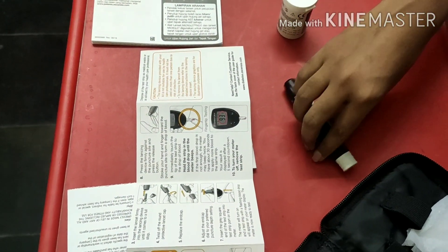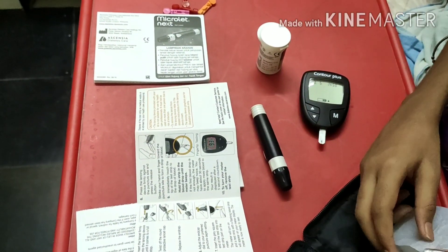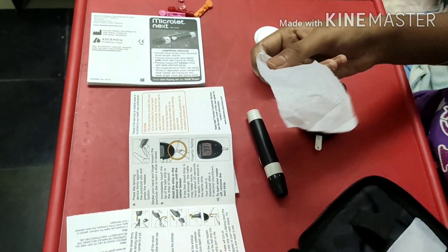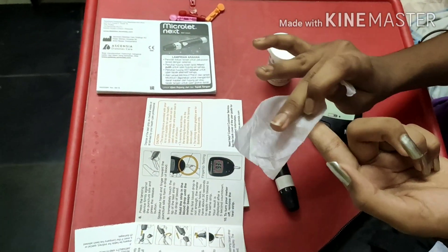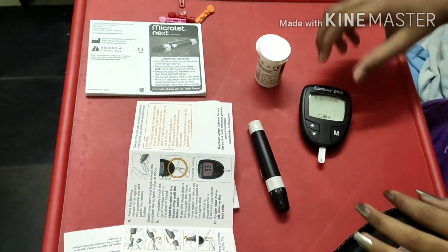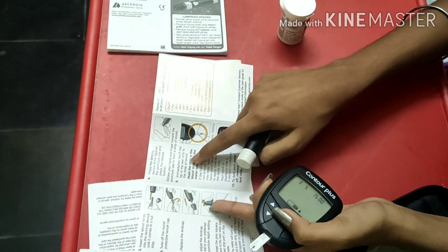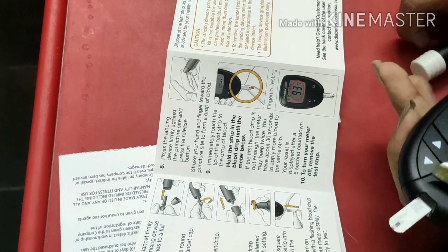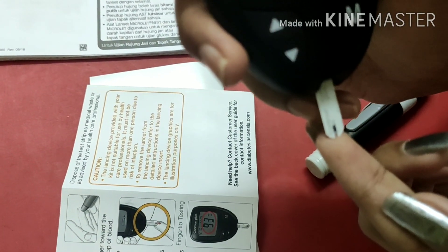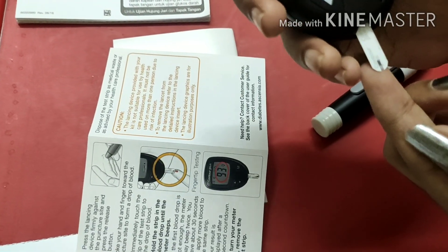Before giving blood, you should clean your hand with an alcohol wipe or any other alcohol sanitizer. Rub your finger well. Then prick your finger — when one drop of blood comes, just touch the strip lightly like this. Don't press hard — just touch it gently.